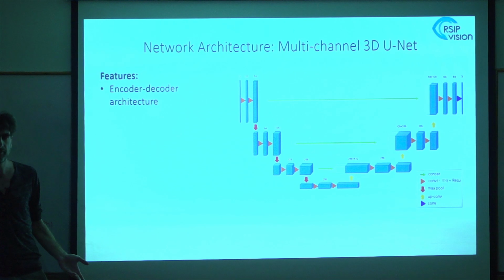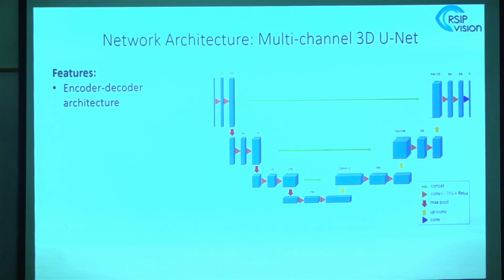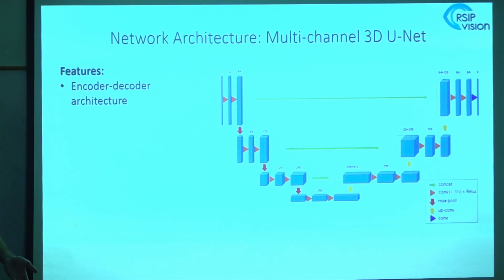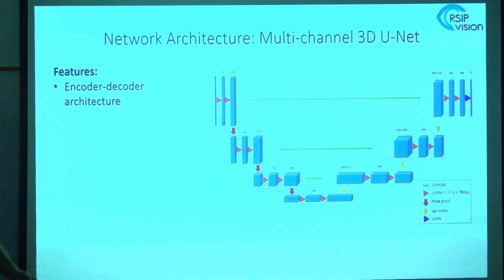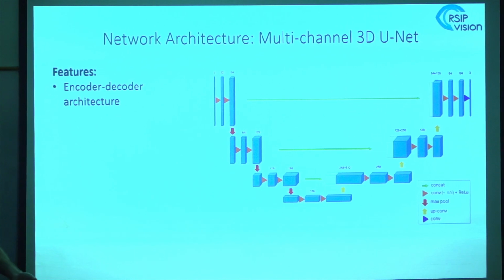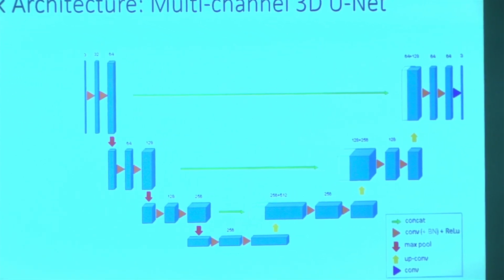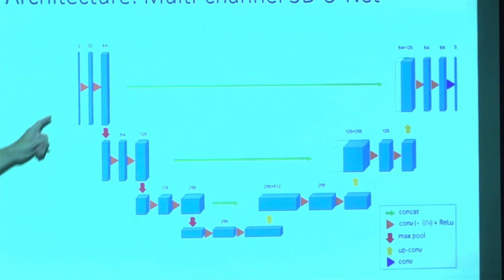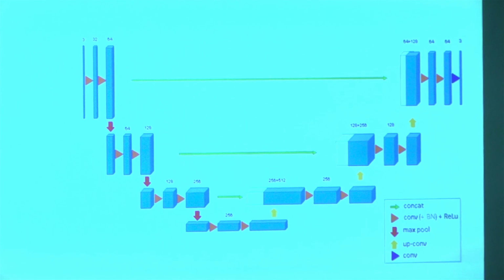So a few words about the architecture. This is a neural network architecture known as a 3D U-Net. It's quite common for segmentation tasks. So the basic principle of a neural network is you want to learn the features from the data itself. So what is a feature? A feature can be some filter that's picking up different features in the image. At first it can be edges or corners or certain textures, and then later on, as you get to a higher level representation, it can represent more interesting features of the image. And there's some nonlinearity, so each step here represents the convolutions, a bank of these filters that the system is going to learn from the training data, and some nonlinearity.